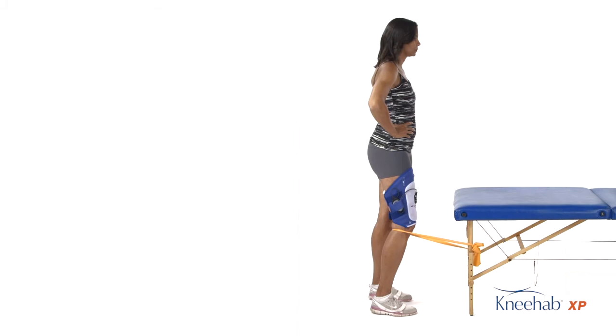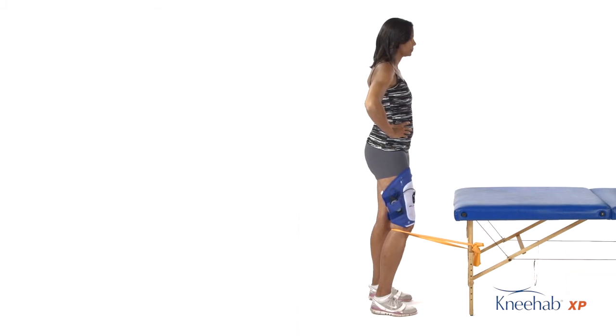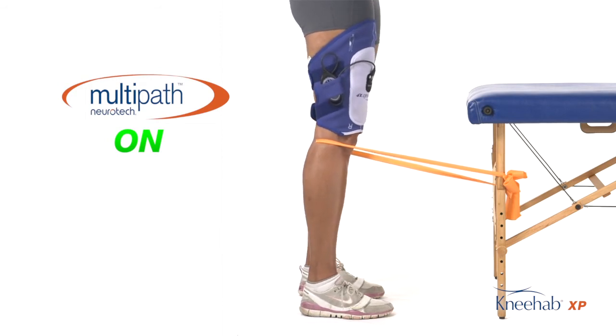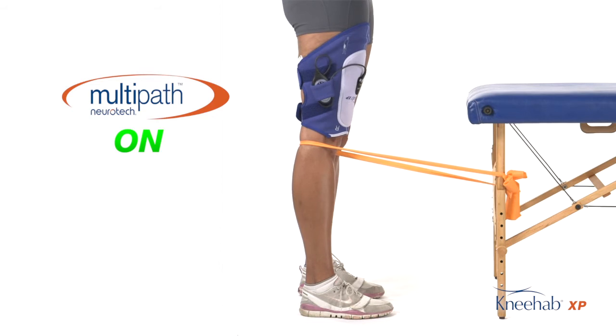The level 2 exercise in standing is a quadricep contraction that brings the knee from a slight bend into a fully straightened position against the resistance of a band. The band is fixed around the back of the knee and tied off at a sturdy table leg or shut into a door. If a pad is needed for comfort behind the knee, please do so. When the contraction of the device comes on, the patient pulls the knee back straight against the resistance of the band and holds for the duration of the contraction.